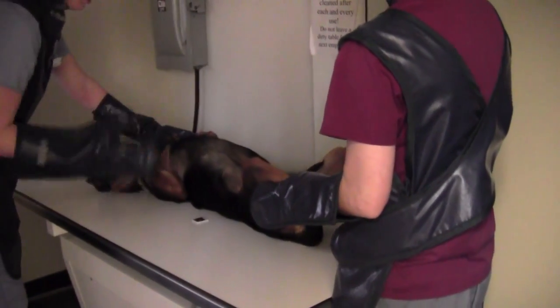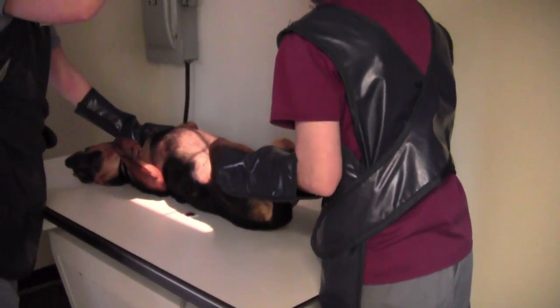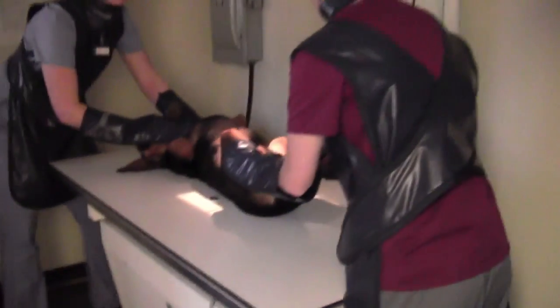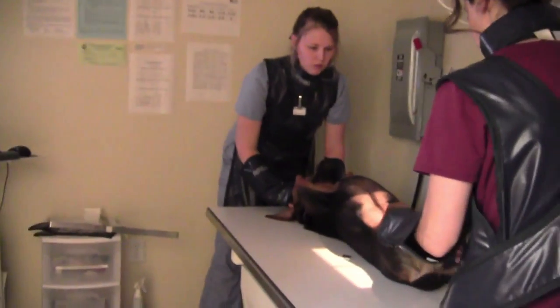It may be a good idea to use a trough when taking a VD x-ray to ensure that there is a straight line connecting the point of the nose to the caudal midline. The marker can be placed on either side of the abdomen, as long as it's in view.